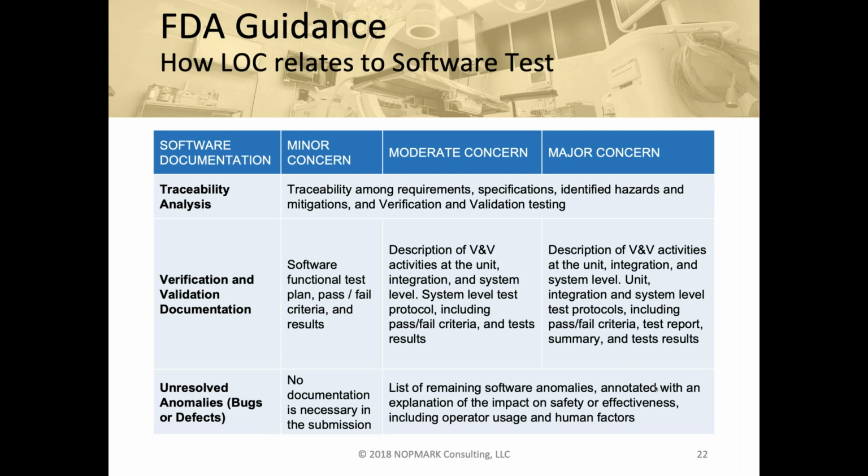You have to look at how that software defect impacts the safety of the software, and how it impacts the effectiveness of the software. And you have a third aspect: does it impede the workflow? If a doctor needs to use the software to accomplish a certain task within 2 minutes, does the bug make that take 5 minutes or 10 minutes? If you're impacting the workflow the doctor has in using the software, that is also important to consider in the bugs.